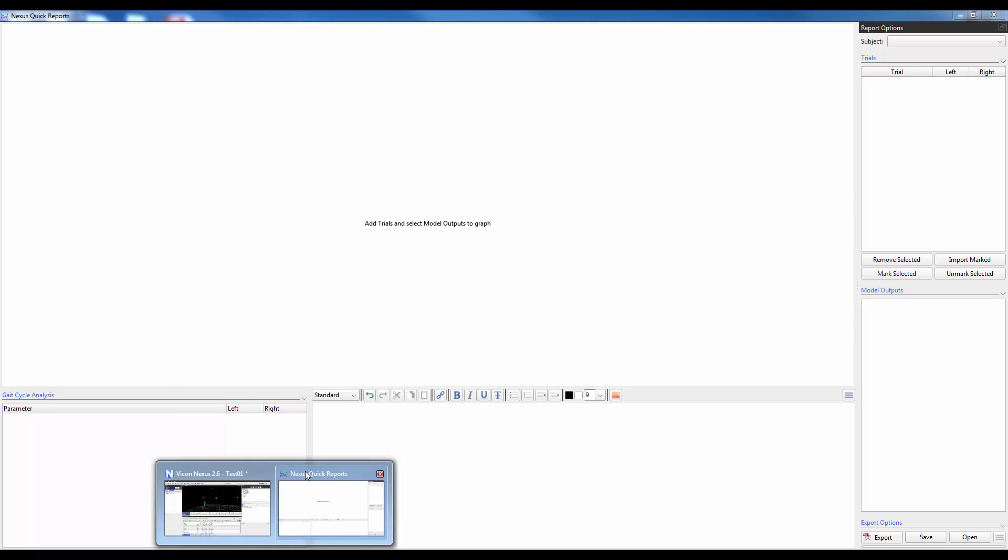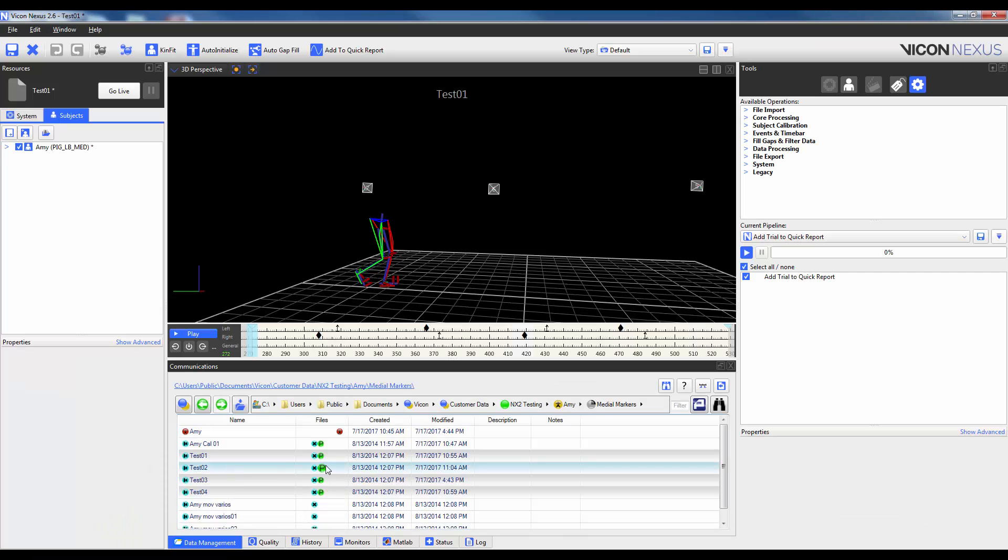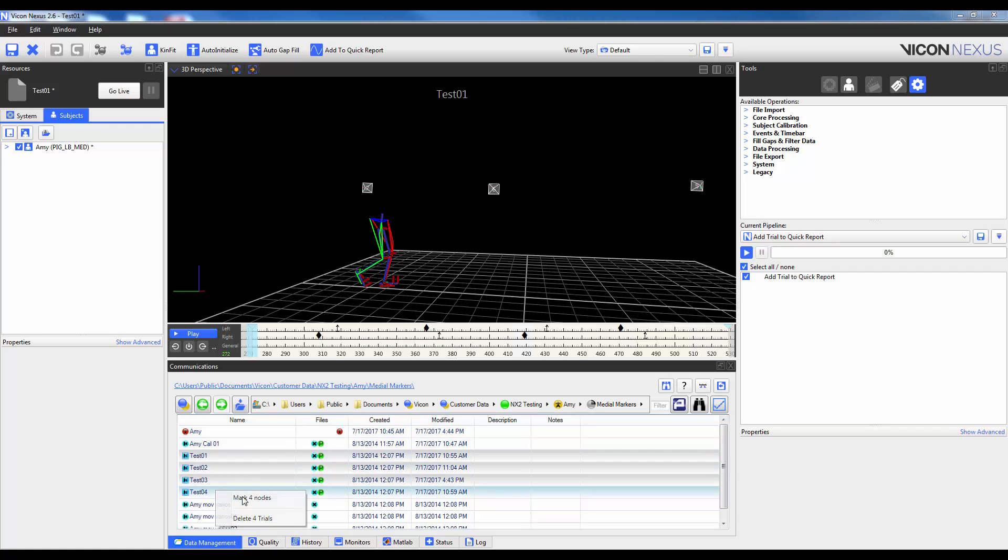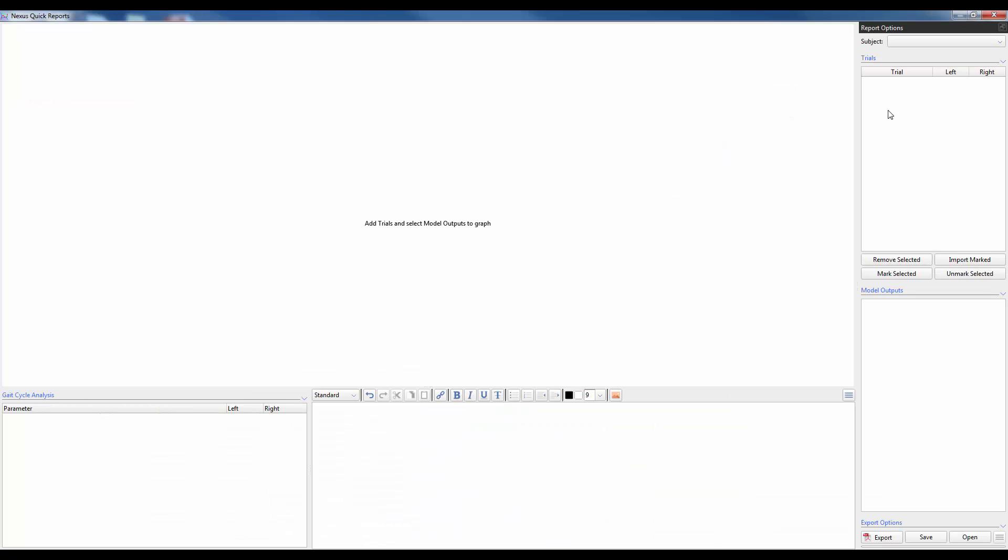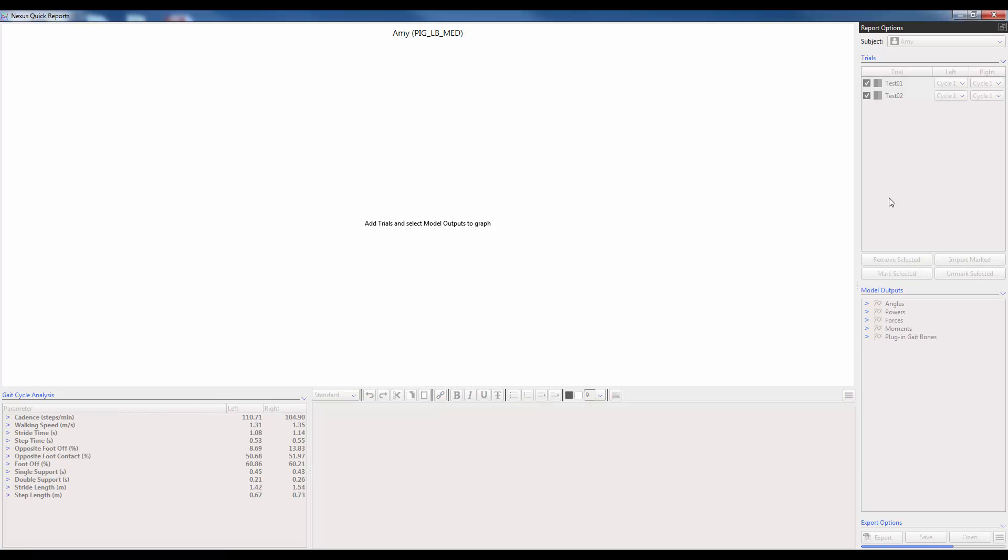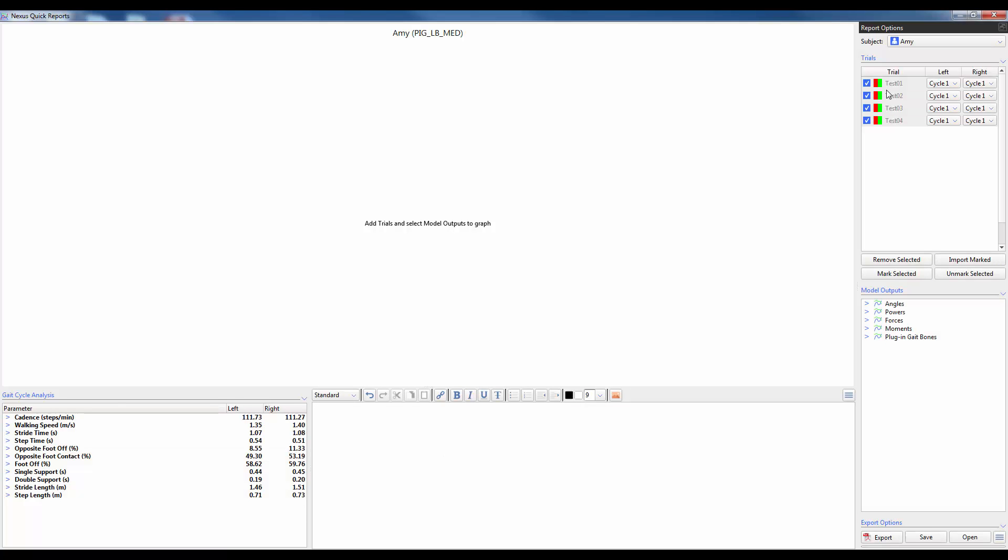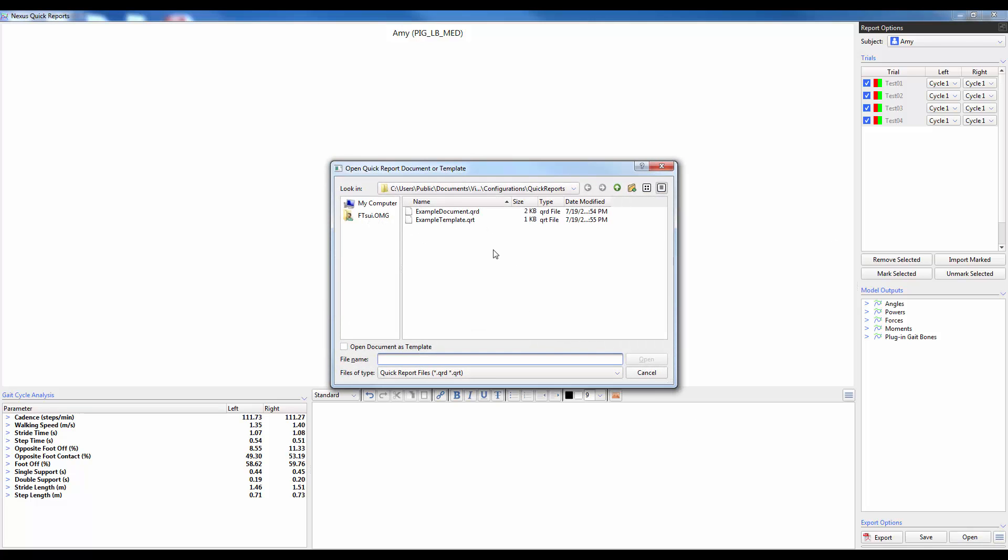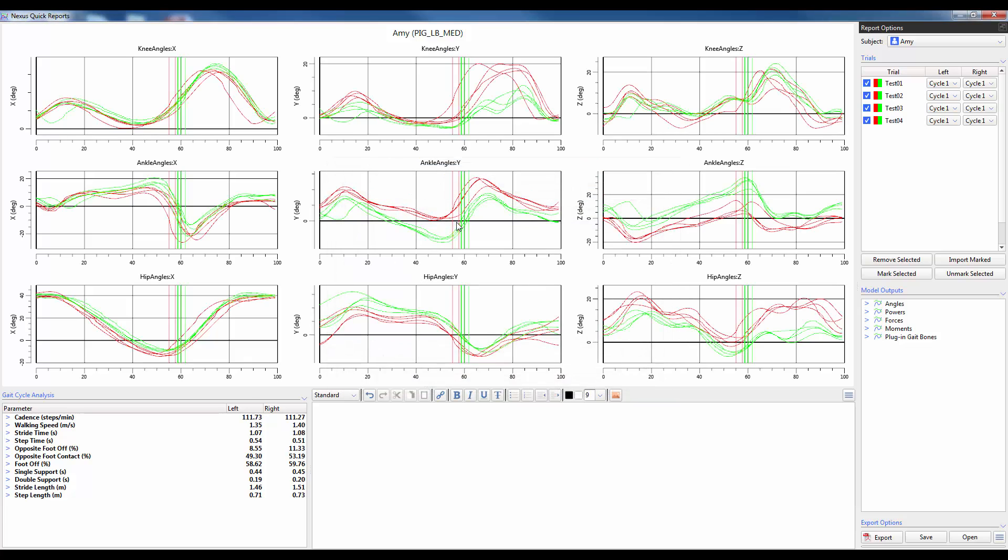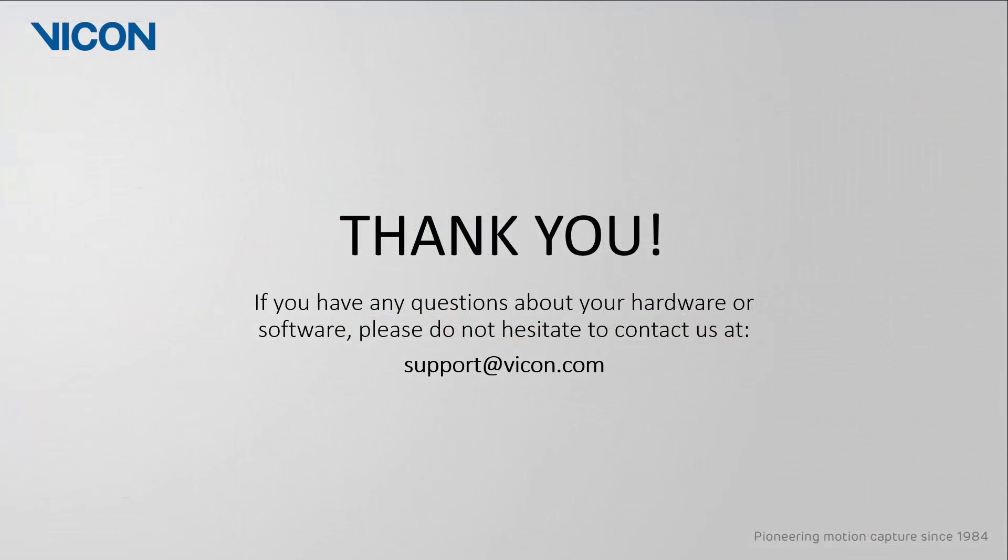In Nexus now, if I was to go ahead and create a new report or upload some new trials, I can go ahead and upload the trials one to four again by marking the four nodes. Coming into quick reports and we can see that after I import the marked trials, that they are populated but I don't have any model outputs. I can go ahead and open the template and it's automatically pulled in the same model outputs that I had saved when I had created the template.